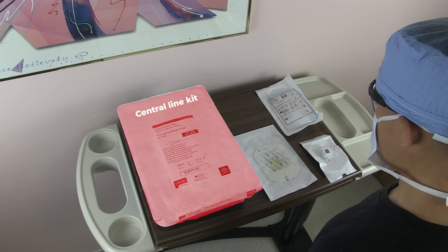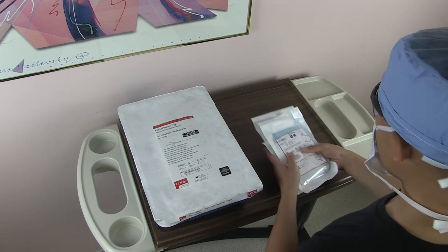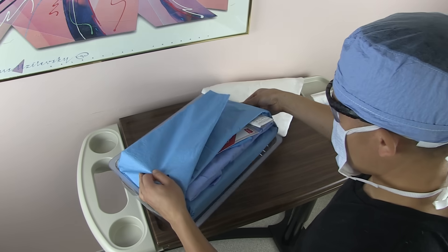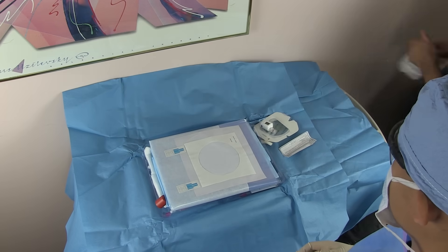Central line kits are awesome and have most of what you need, but there's always something missing, so you have to know what you're getting in the kits. In this case, I also know I'll need an ultrasound, a sterile ultrasound probe cover, and a dressing. I open up the kit and put on the rest of the included PPE. Let's familiarize ourselves with the rest of the contents of the kit.